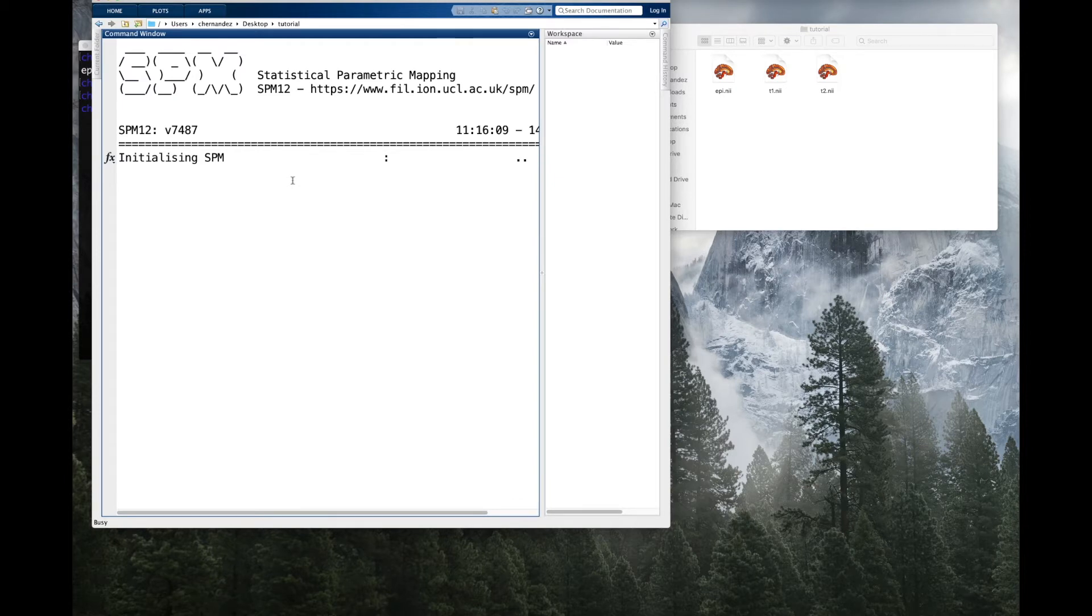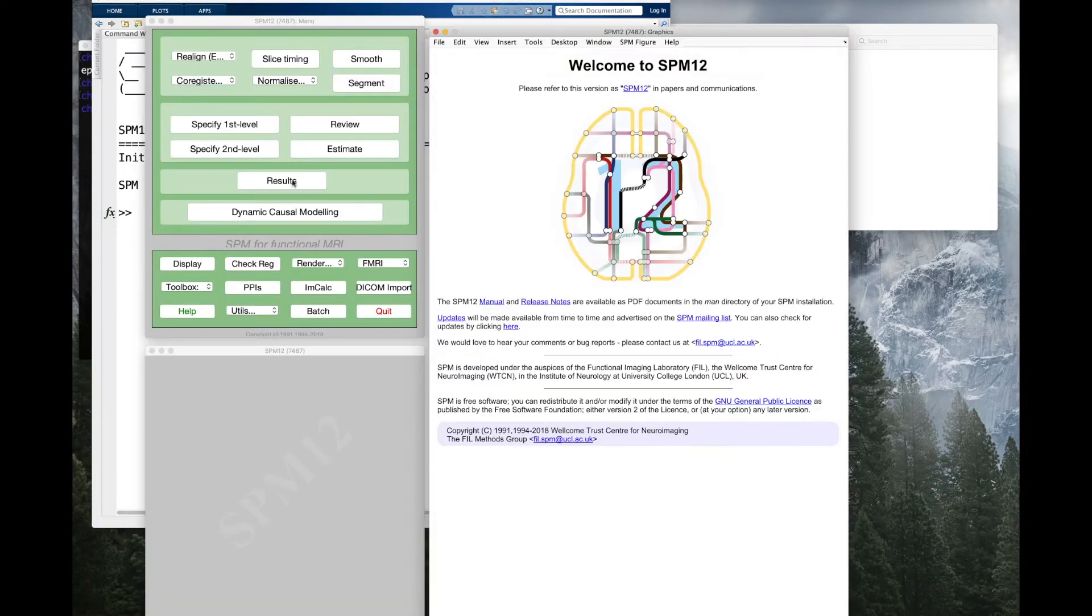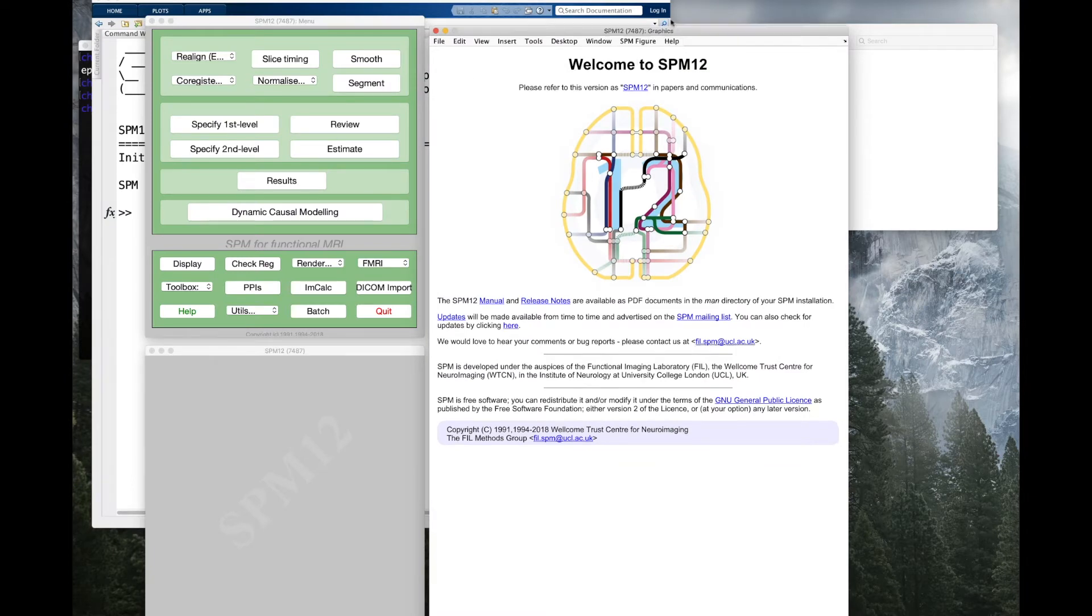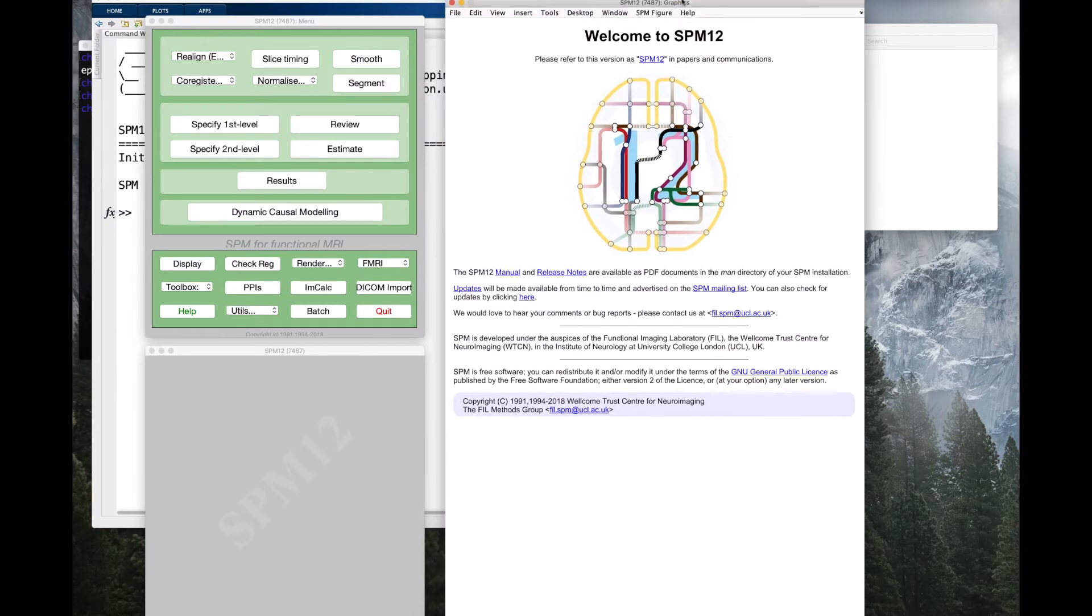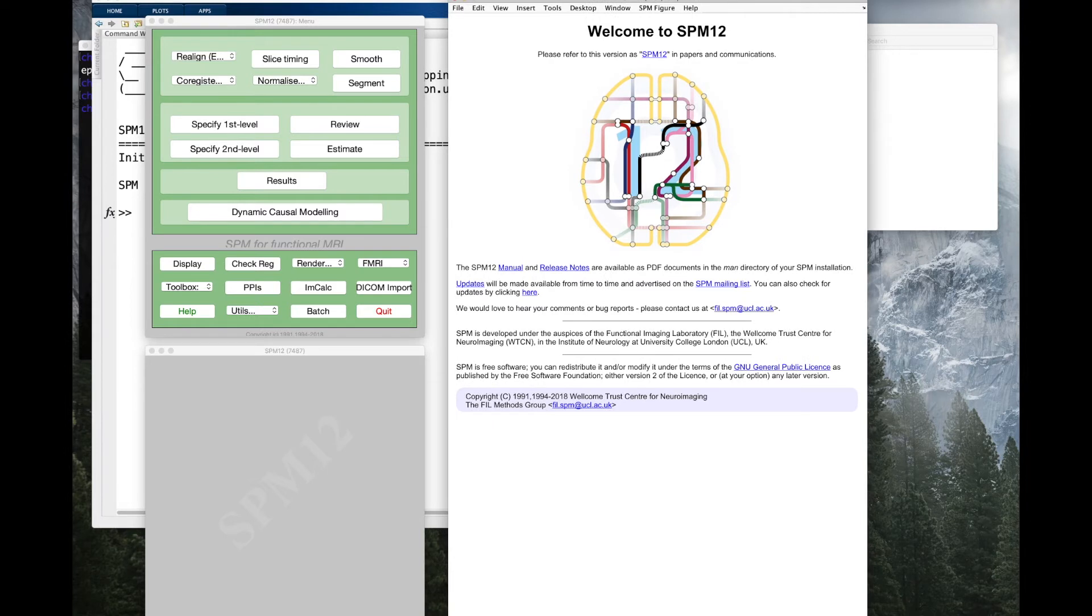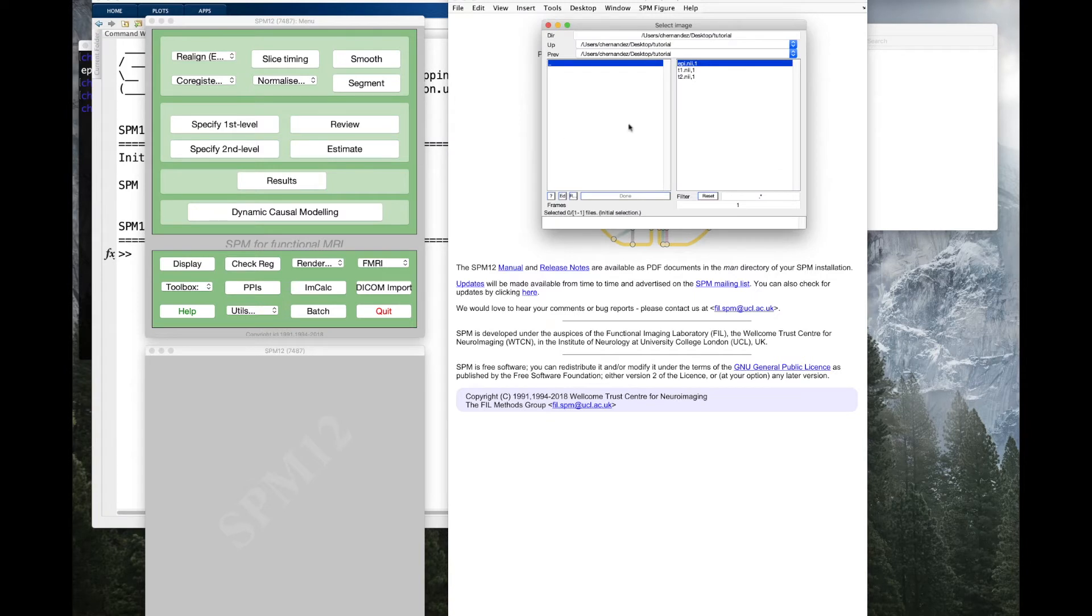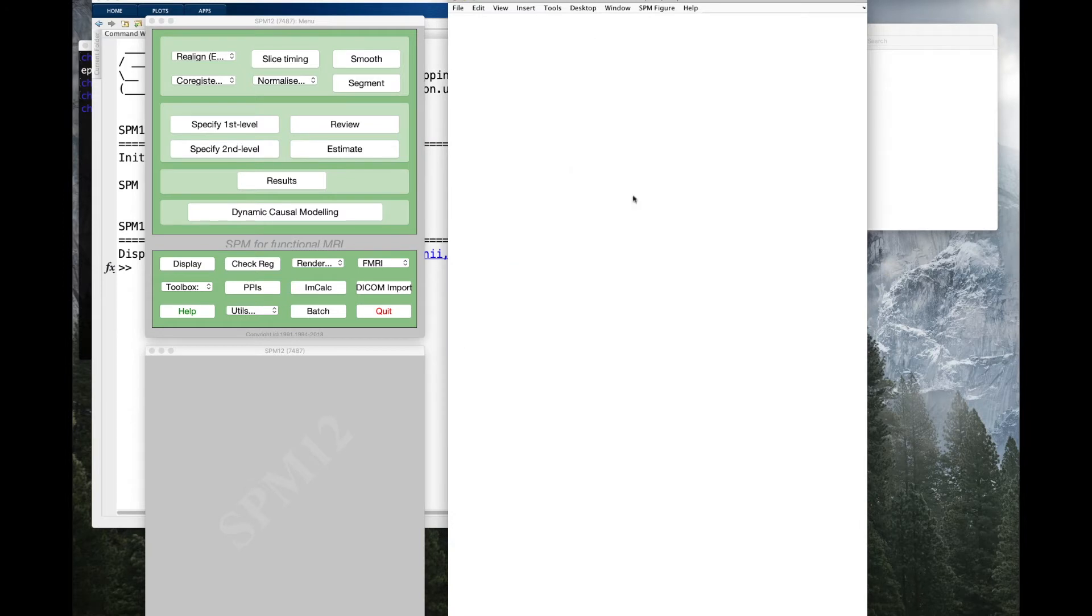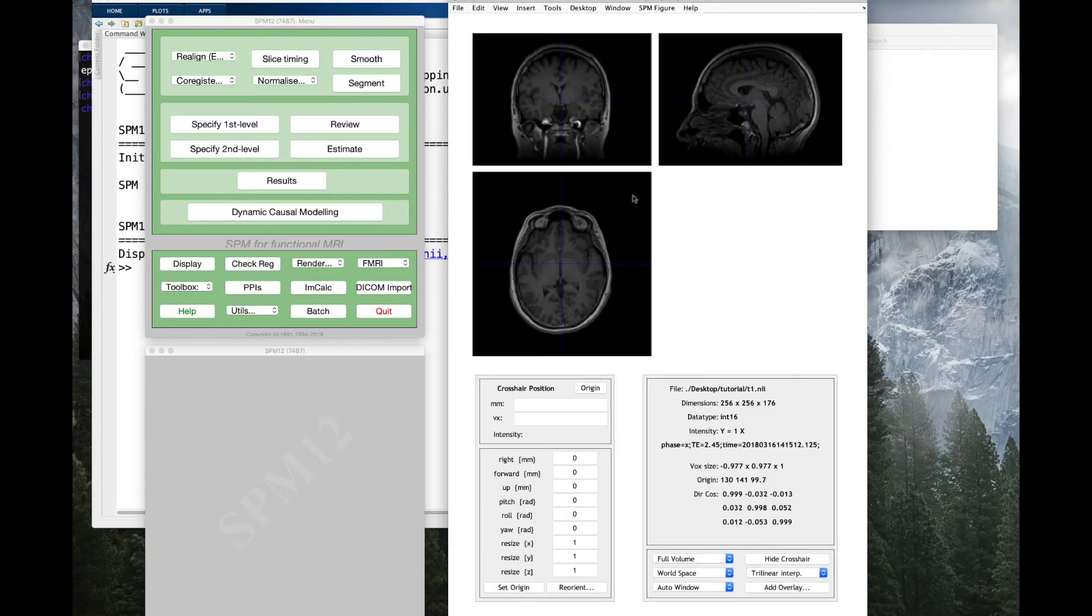The first thing you need to do is to check that your images is in LPI orientation. If your images came out from the scanner in a different orientation, then they should be resliced. The second step is to set the origin of the image into the anterior commissure. This operation is necessary for the normalization.